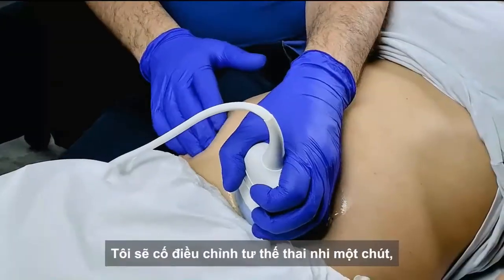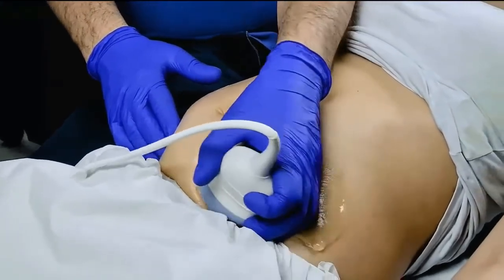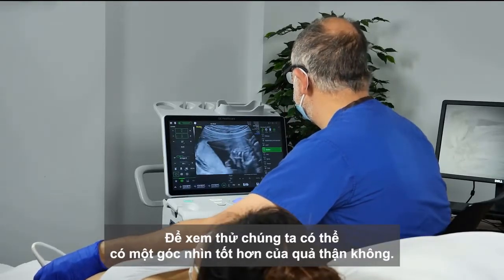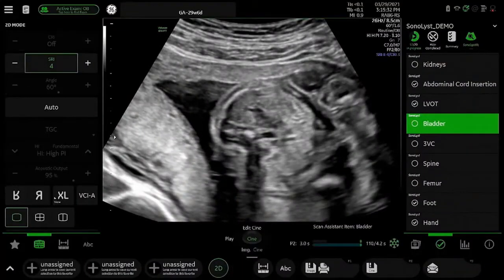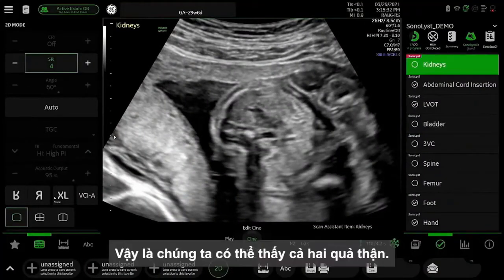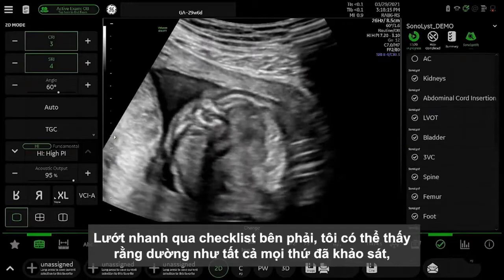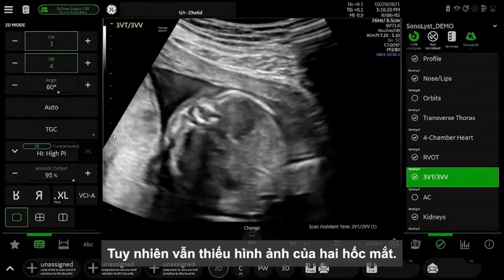So I'll try and give the baby a little prod if I can, just to see if we can get a slightly better view of the kidneys there. So recognizing that both the kidneys are there. So if I have a quick look, I can see that pretty much everything is done. I'm missing a picture of the orbits.